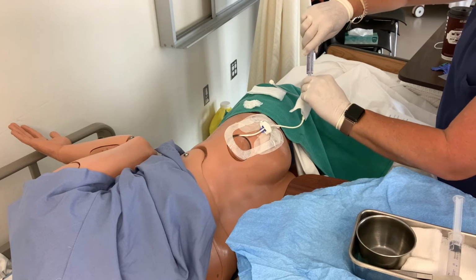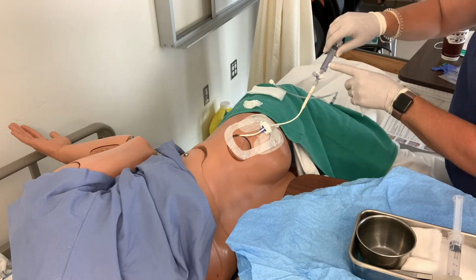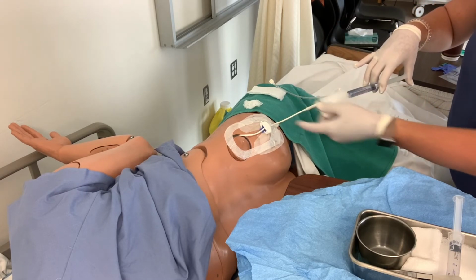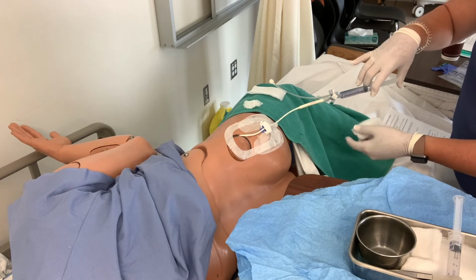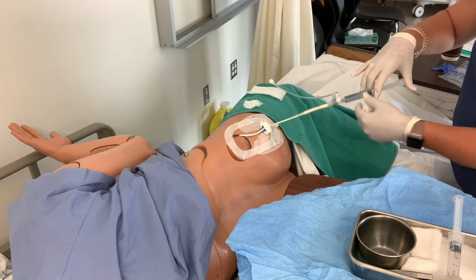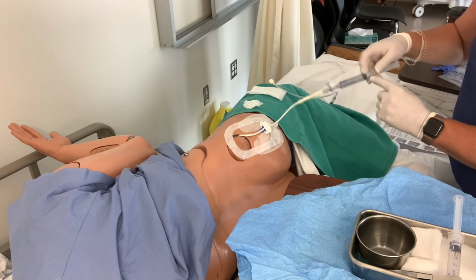I'm now going to open up the highway. Okay, so get the off away from it so that the highway is kind of open. And then I would flush the patient. Now, obviously, this is a mannequin, and I'm not going to flush it, but I would gently push, pause, push, pause, push, pause, till I got the whole 10 in. This patient is ordered to have 20, so I want to push that in.